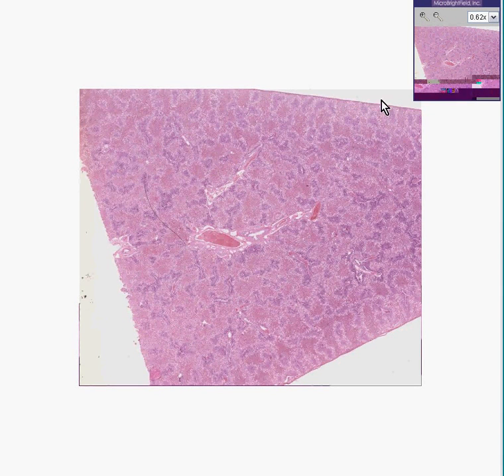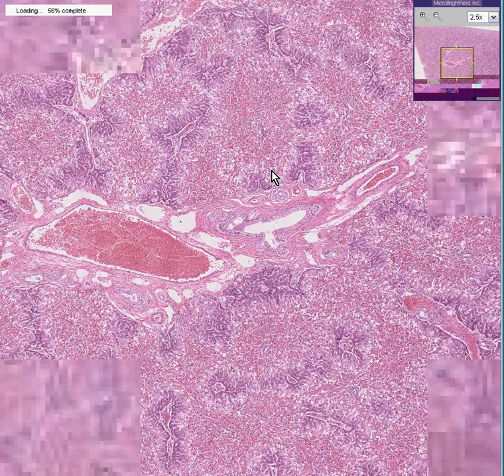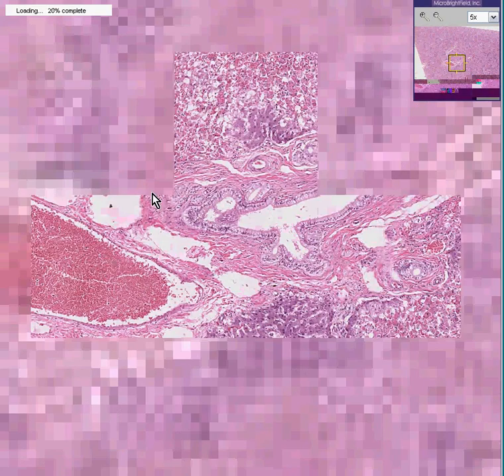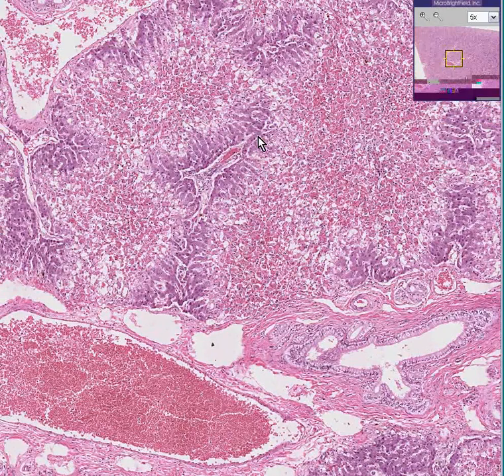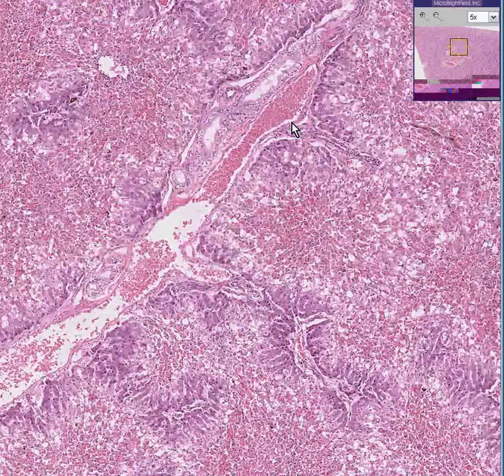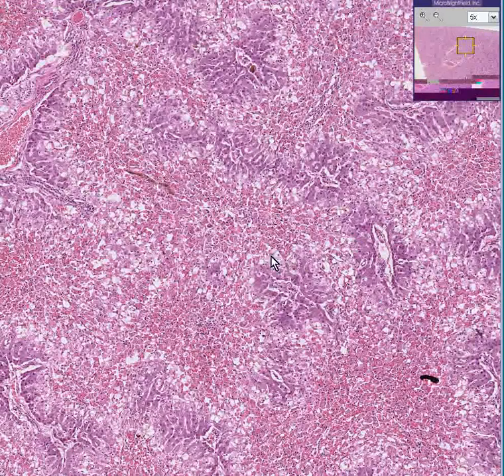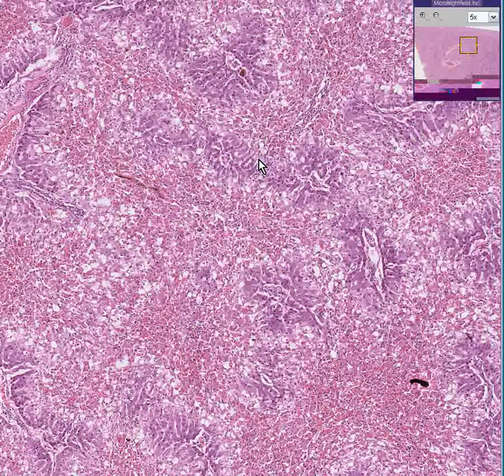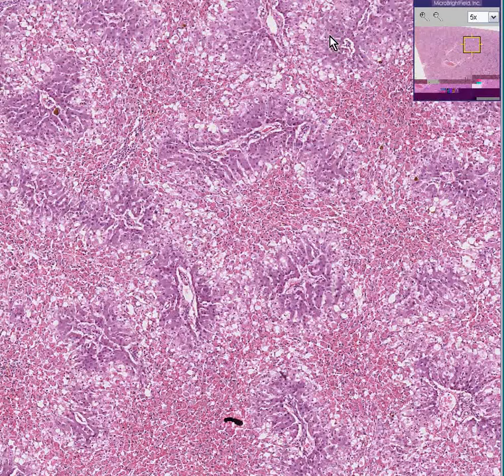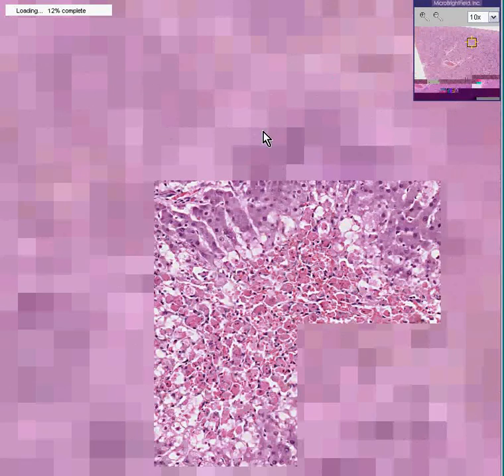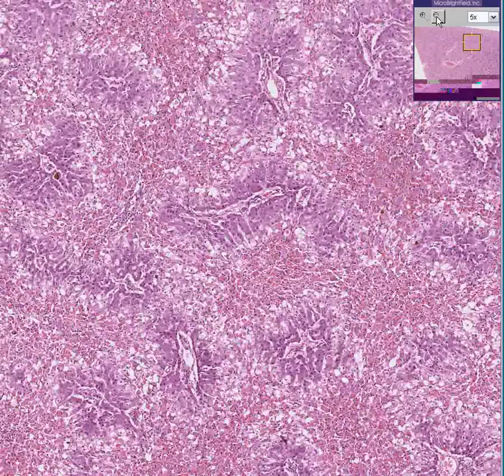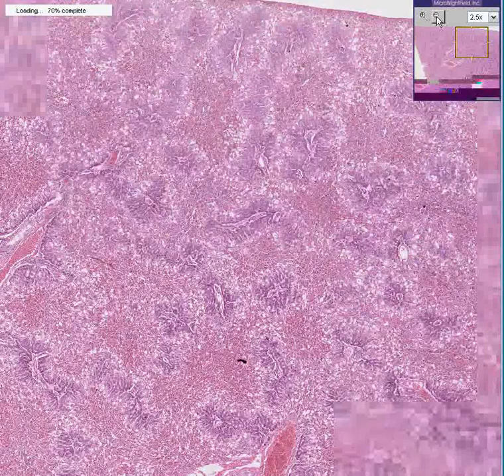This is a pretty spectacular case. You can't recognize this as liver because it doesn't look like liver, but when you zoom in a couple of notches you can clearly start to see some sinusoids. You can see that the areas around the portal triads — going to a smaller area here — where you can see bile ducts and arteries and all your classical things in the portal triad — you can still see that there are some residual sinusoids and cords in these areas.